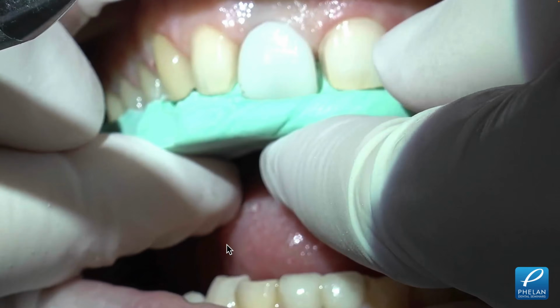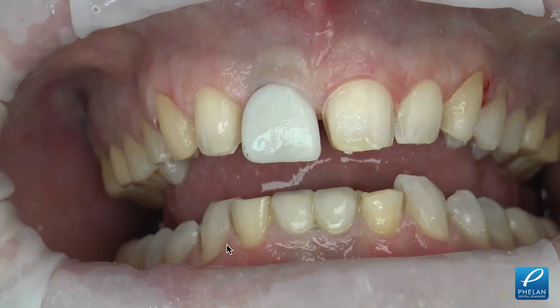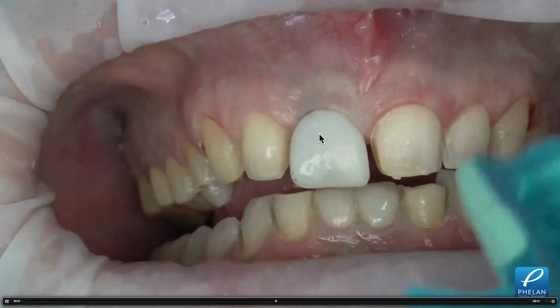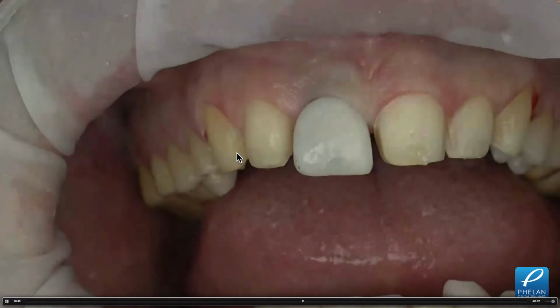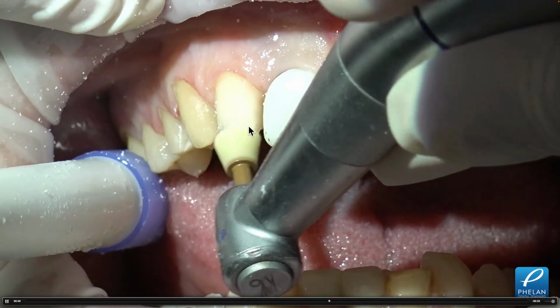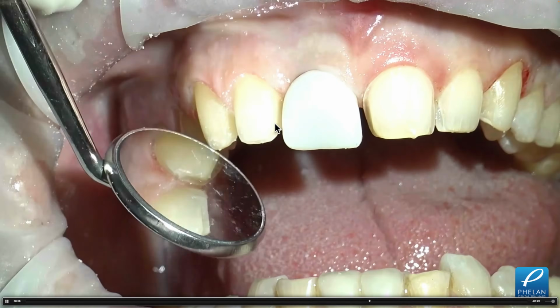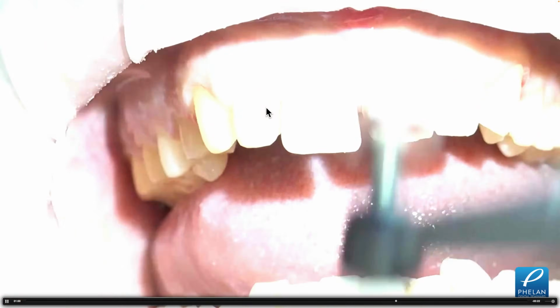So here you're just seeing the incisal putty, the other putty. You can see how I've improved this gingival level. I did that near the beginning of the appointment. Some finalizing. You can see now we've got better depth of preparation, but we still have all enamel in the prep, at least up until the mesial section where we had to prep it down to the palatal to get a good contact against the implant crown.